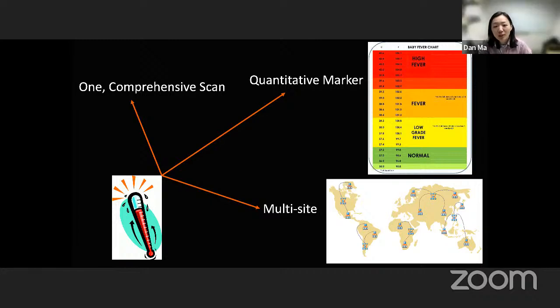So the biggest obstacle, I guess, translation-wise, is that the MR fingerprinting scan is still not a routine scan. It takes a long time for people to implement and validate this. And in terms of reconstruction, typical reconstruction is long. So we're also trying to accelerate the reconstruction, so that after the scan it won't take hours to get the images. That's also very critical for clinical translation. One thing is fast scan. The other is a very fast turnaround time before you see the maps. So that's the technical side.